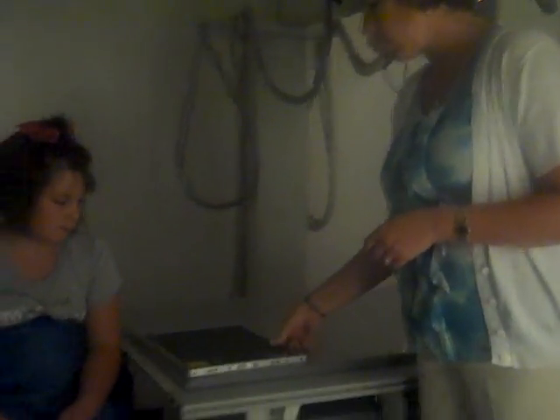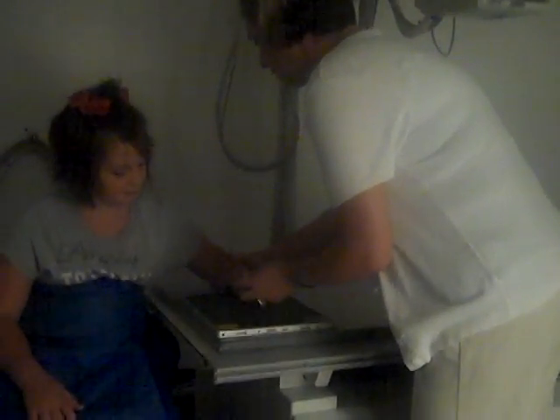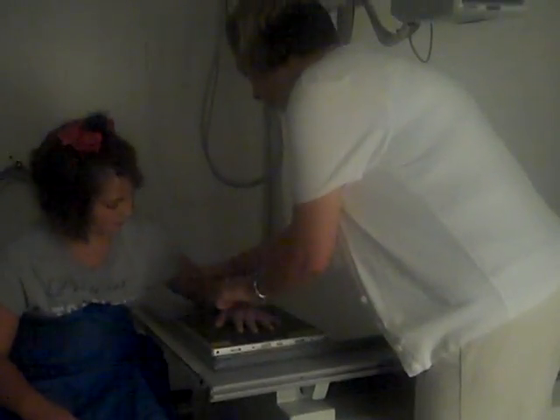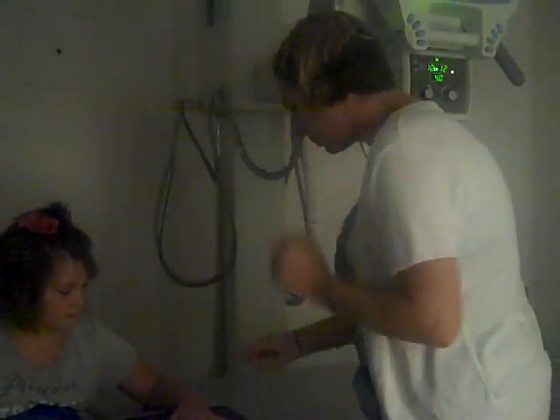I'm going to take my 10x12, or your 8x10 if you have one, and place it next to our patient. I'm going to have her bring her elbow over and then rest her hand right down in the middle. I want to make sure that we have a 90-degree angle bend here from the elbow to the forearm to make sure that we have a nice straight alignment through our carpals.